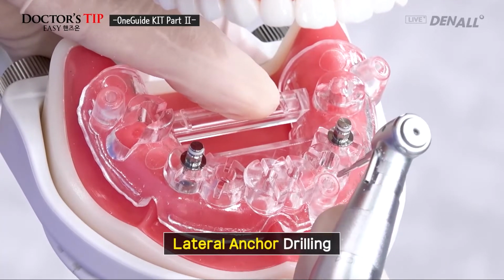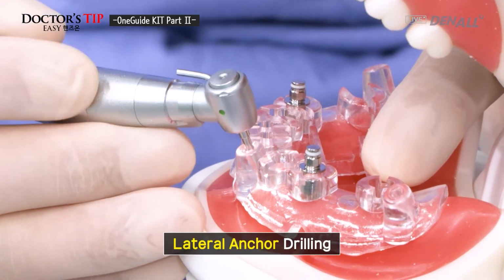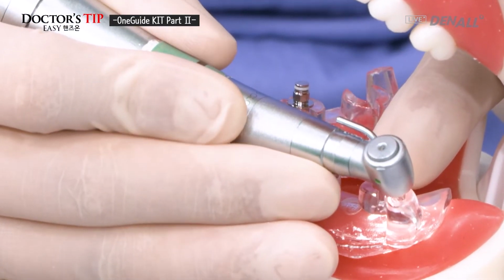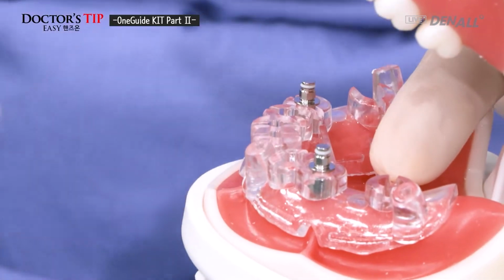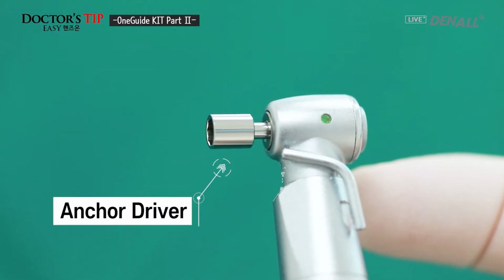Drilling is now going to be done on the anchor site. As shown, number 30, posterior side, anchor drilling is done. Number 40, anchor drill is being done. Now it's mounted. You're going to connect the driver for anchor.